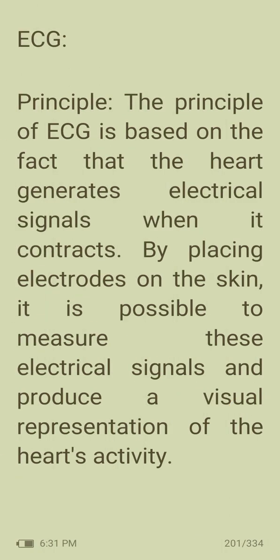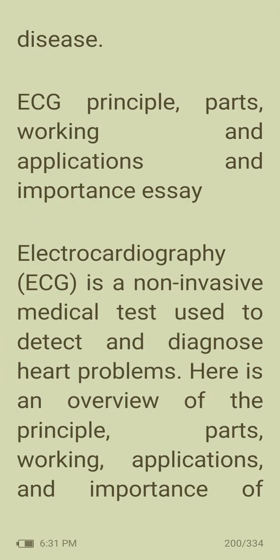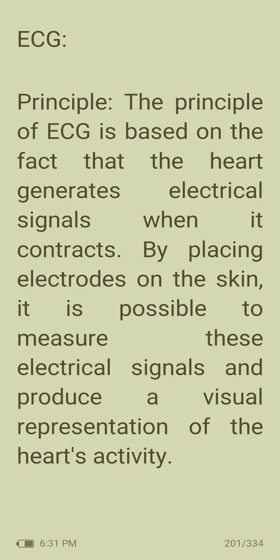And the principle behind electrocardiography. Electroencephalography is coming; we will be learning about it after this one. So, the principle of ECG is based on the fact that the heart generates electrical signals when it contracts.